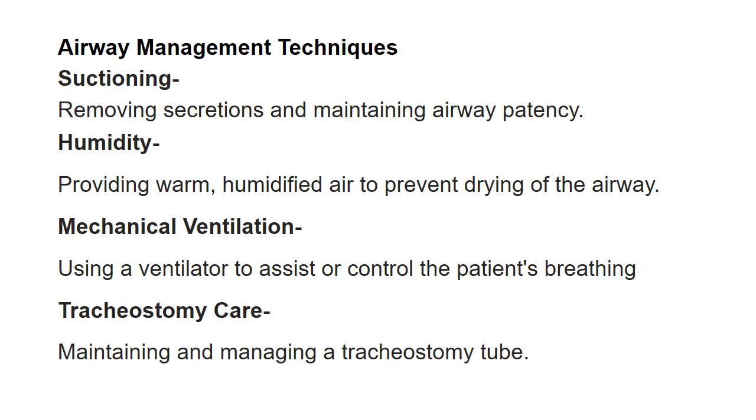Mechanical ventilation. Using a ventilator to assist or control the patient's breathing is important. And lastly, tracheostomy care. Maintaining and managing tracheostomy care is very important. Always take care of the tracheostomy wound and tracheostomy tube.